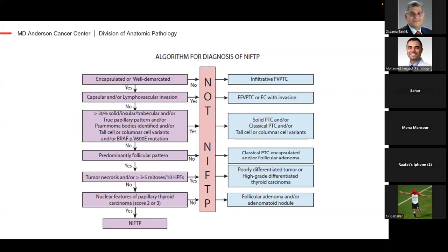Okay, I think now we're done with NIFTP. Just one thing before I move on. If you have this lesion without PTC features, then you're looking at follicular adenomas and follicular carcinomas, right? So if you don't have the PTC features, you're on the follicular carcinoma side. Does anyone have any questions? Let me see if there are any questions in the chat.